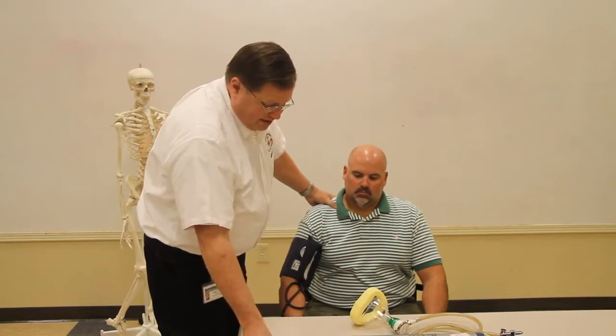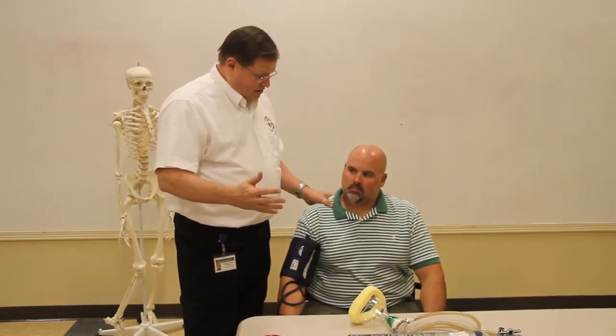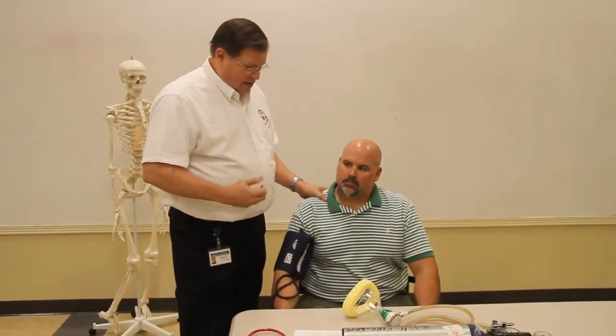Lee, on a scale from 1 to 10, with 1 being the least and 10 being the greatest, where's your pain? A 9. The next thing I would do, after I got his vital signs and obtained a history, is inform him that I would like to give him some nitrous oxide. Has he ever had any problems at the dentist with nitrous oxide or any other type of thing?